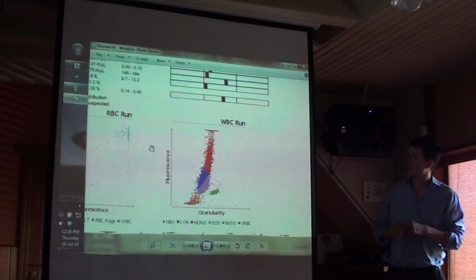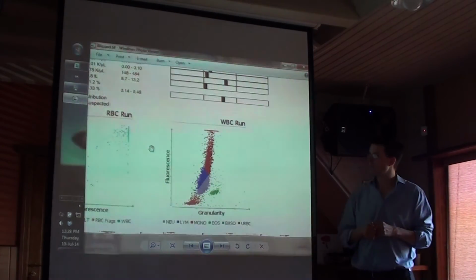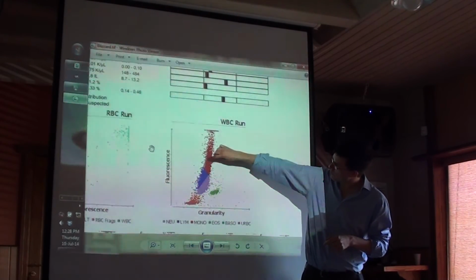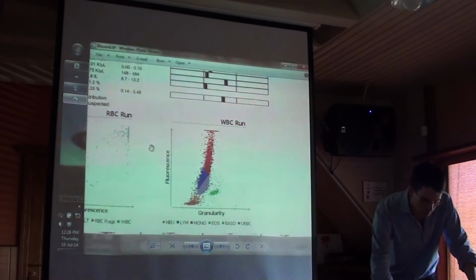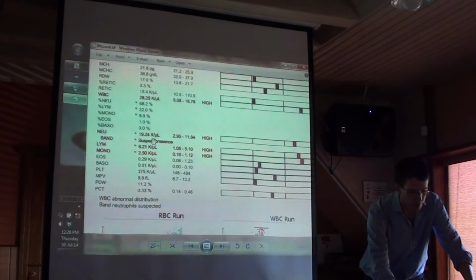What about the white blood cell differential? Are we happy with the numbers? We have not separated the purple from the blue from the red. So we look to the stars and we understand why they're marked with an asterisk.